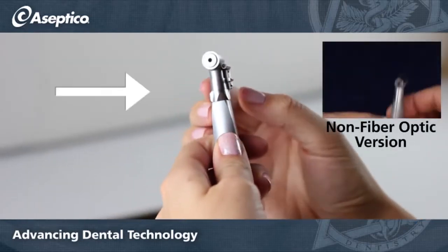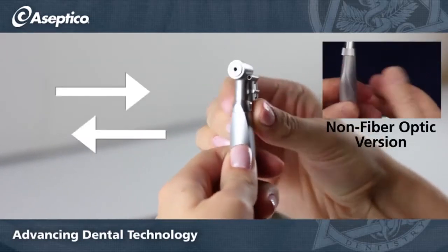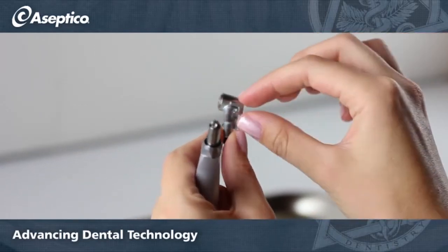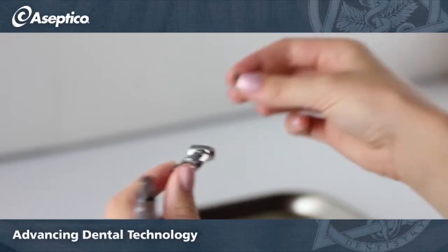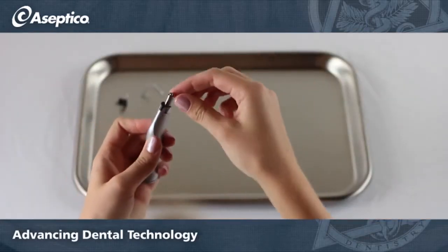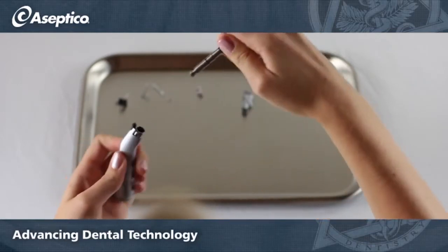You can rotate the neck of the handpiece either right or left to release the head. Pull the head up and it will come loose. The depth stop adapter will slide right off. The drive shaft assembly may be slippery from oil, but it will pull free with a firm grasp.